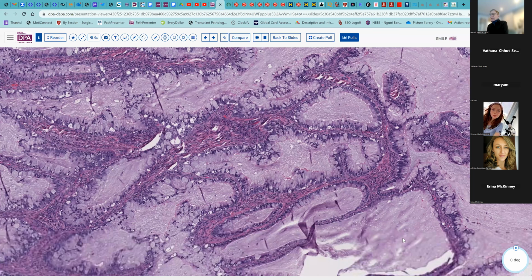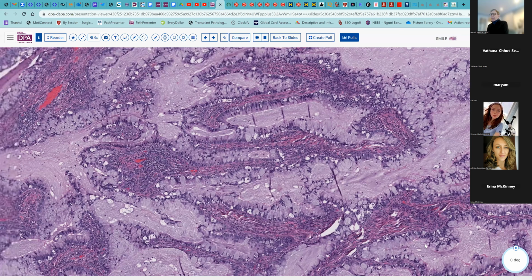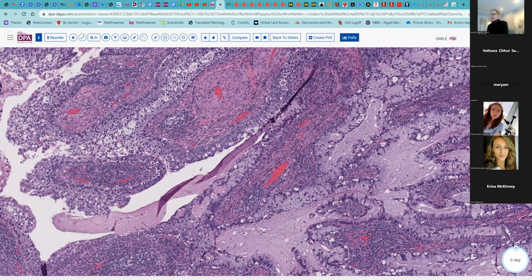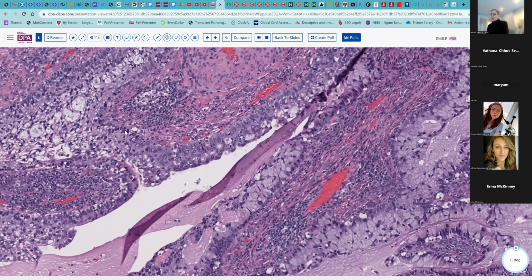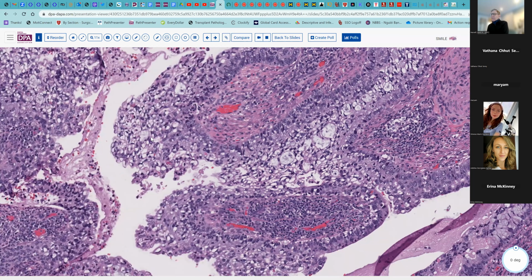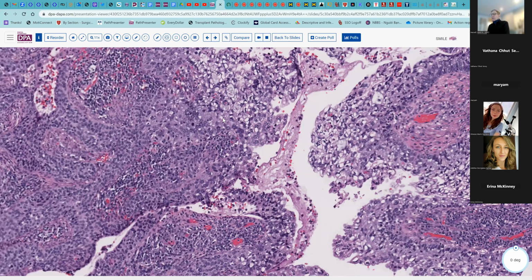But as we look around on this area or this lesion elsewhere, we see these more conventional areas of what is the typical description of stratified mucinous intraepithelial neoplasia, which shows here this stratification, multi-levels, and areas of mucin production. And sometimes that can be like here. Here it's much more clearly stratified, and many of these vacuoles are not squamous vacuoles, but these are mucin droplets in the cytoplasm here.